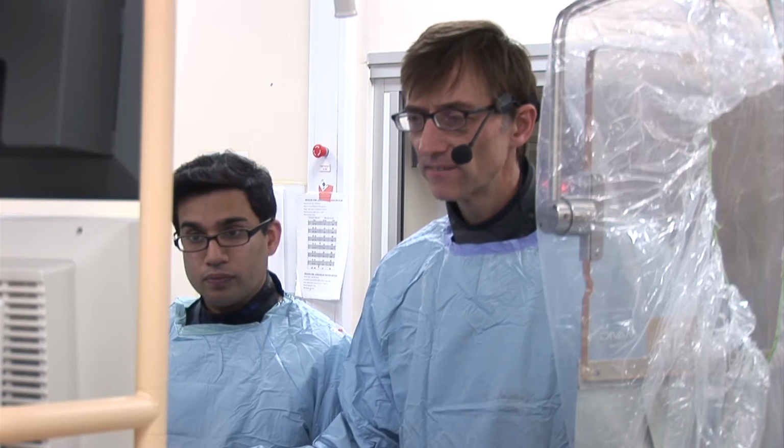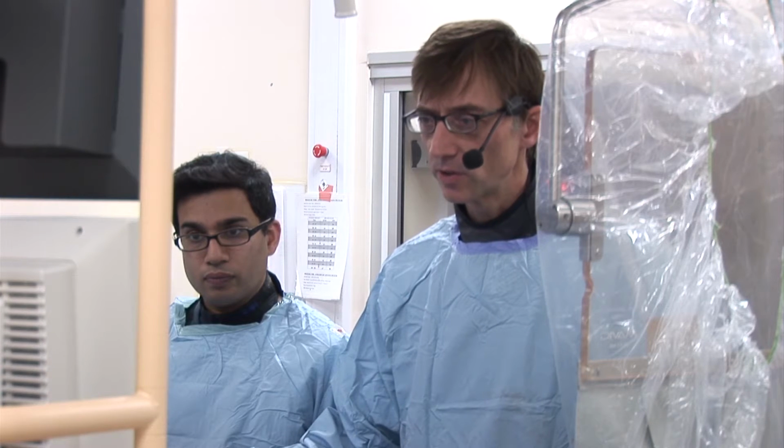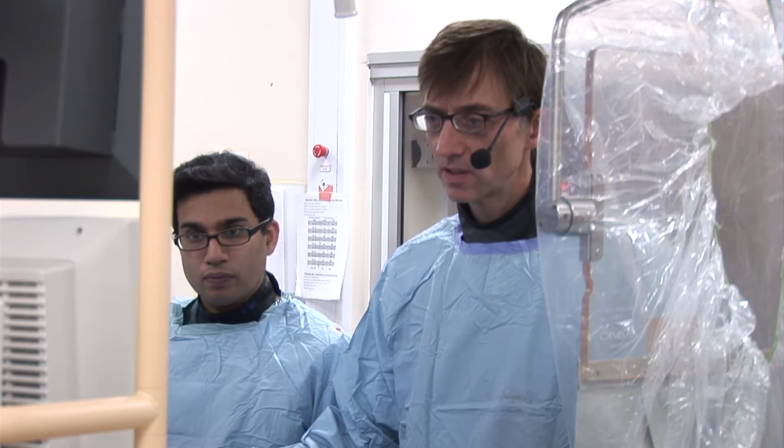As they try to do this, you can see that the guiding catheter gets pushed out and all the equipment falls out into the aortic root. Fortunately, as the vessel has been stented open, it's quite easy to re-engage a new guide and re-advance a wire down the vessel. Here, the area that was causing the equipment to snag has been dilated to try to allow easier passage of the equipment.